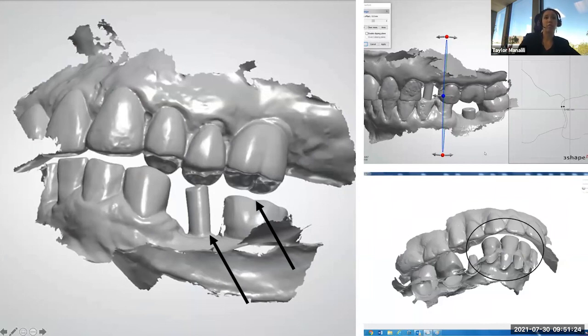We might leave the scanning abutment in, so the patient goes to bite down. They obviously can't bite down all the way. They're hitting a scan body that you have in there. And so we call this an open bite, right? So we capture this incorrect biting position. If you take a minute to evaluate your scan at the very end, you will very easily catch this, right?